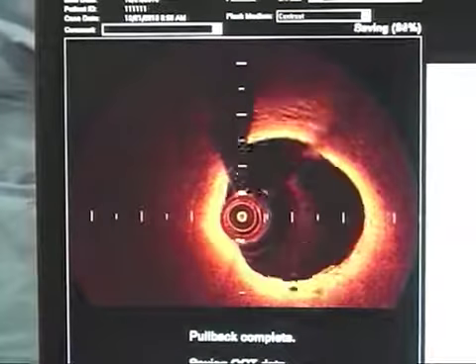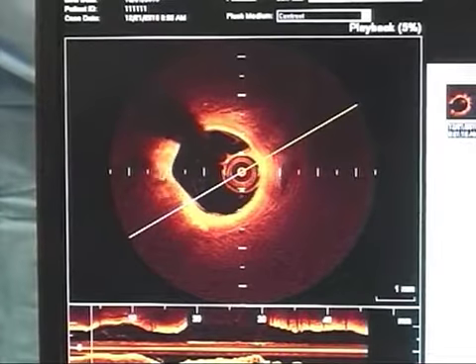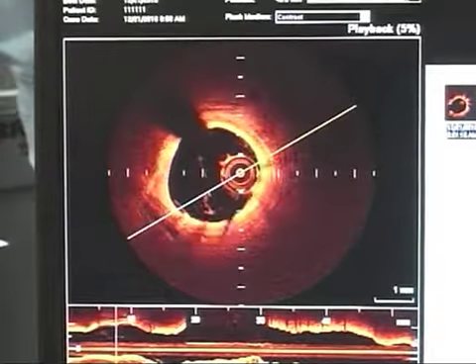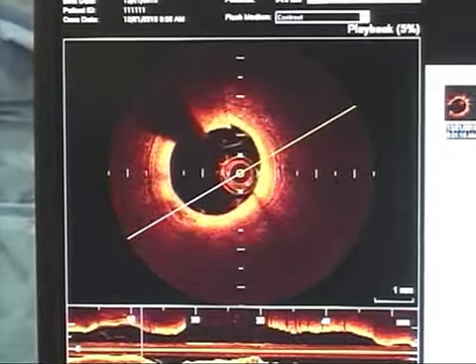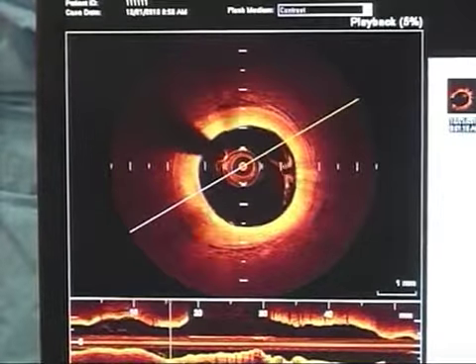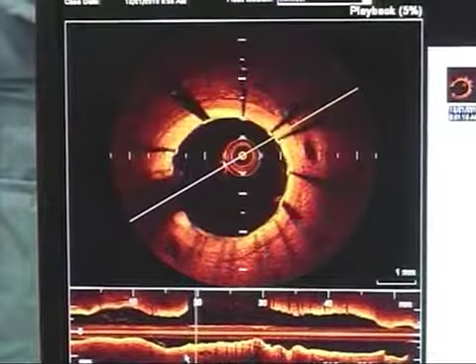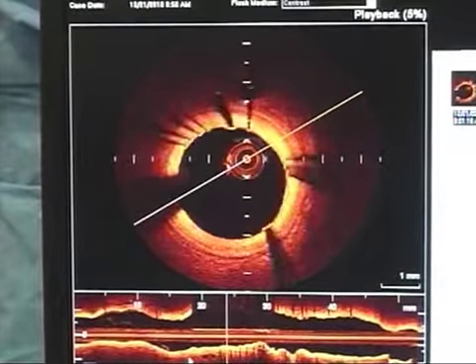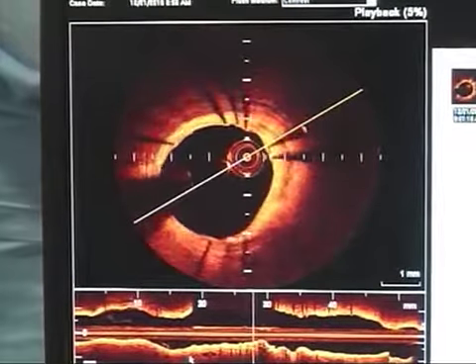Beautiful. So now you can see the three-layer structure of the vessel wall. You see the intima, which is opaque. You see the tunica media, which is lucent. And then you see the adventitia, and you see one plaque you could see at 7. It's a long plaque. You can see it there, and then in the proximal there is probably an artifact. So we have seen that lumen-wise, the circumflex is excellent, and the stent positions are also pretty good.